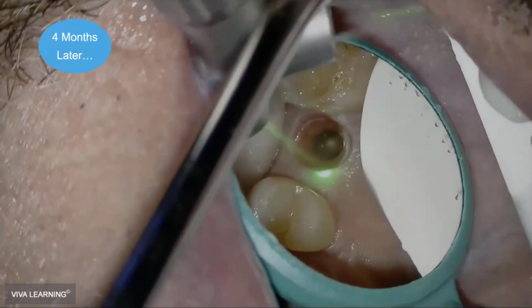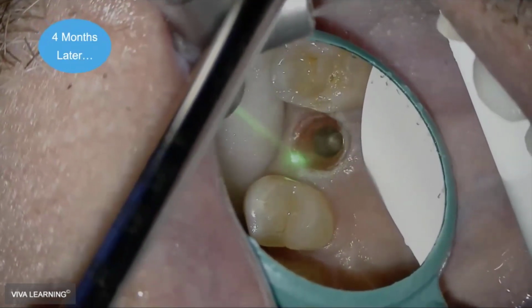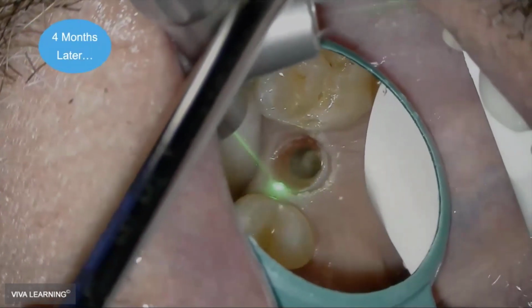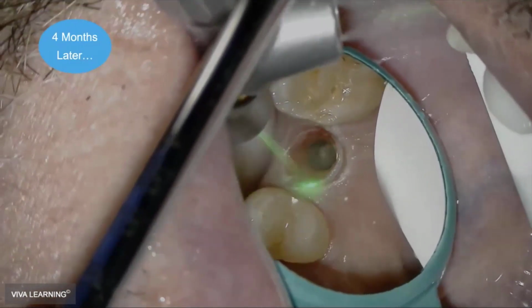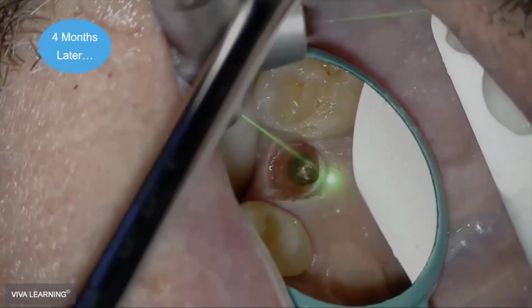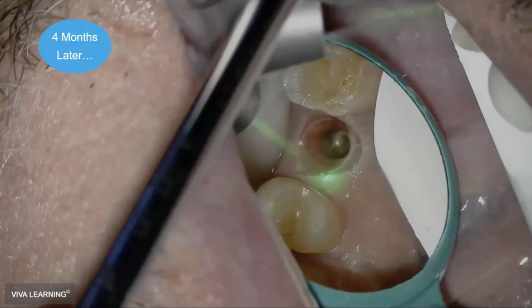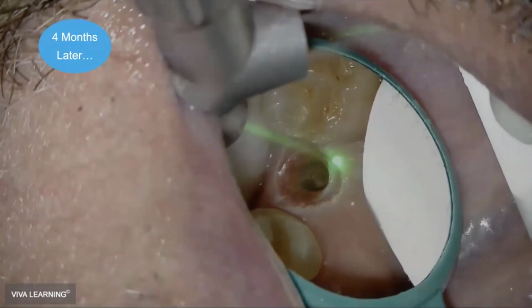So, this patient's anesthesia free. We're just, again, increasing the diameter of this circle. This is a fairly round space, maybe slightly oval. This is going to allow us to take a same-day scan where we can take an image of what that pontic looking space, the emergence profile space, looks like so that we can mill a crown that fits intimately.